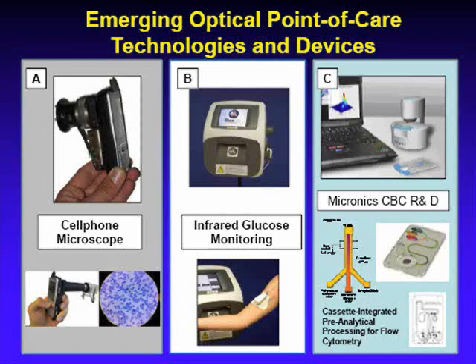So potentially you can do a complete blood count, which measures your platelets, white blood cell count, and red blood cell count to determine the patient's hematological state. In panel B, we have a more recent image of an infrared glucose monitoring device. This is merely a mock-up, so not much has been heard, as I said previously.